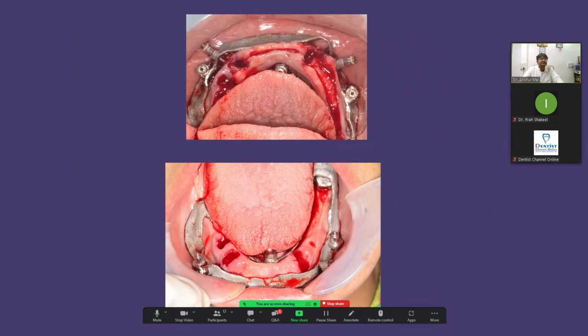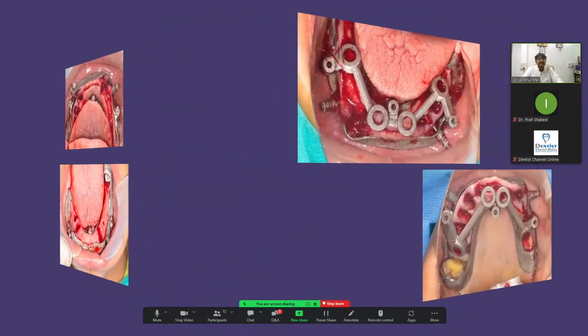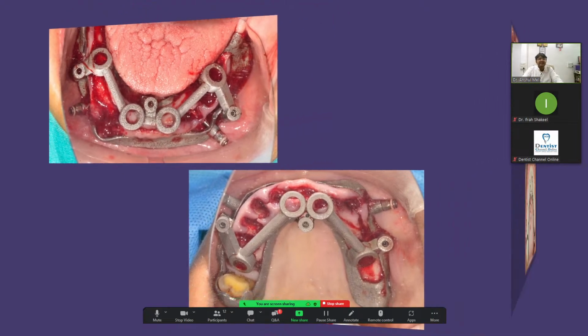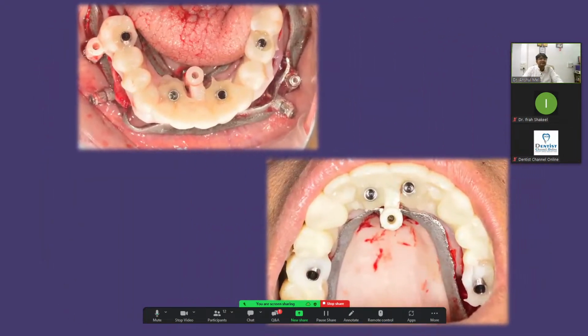we remove all the teeth. After that, with my base guide still inside the mouth, we place the drilling guide on top of it with a screw tape. We do the drilling completely using the drilling guide, and then we insert the implant, place the cylinders, and we pick up, as you have seen in the previous case, we pick up.